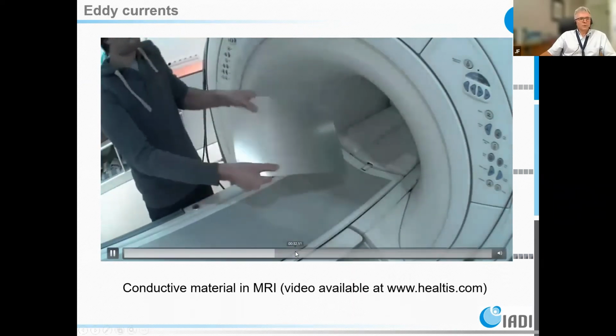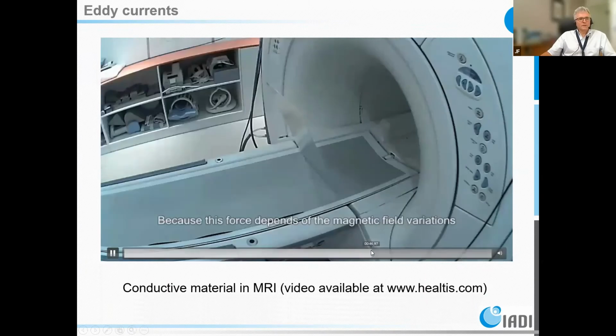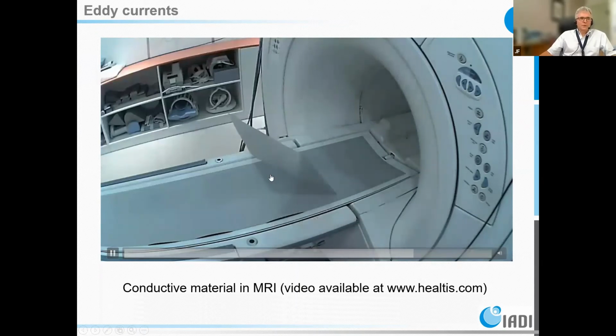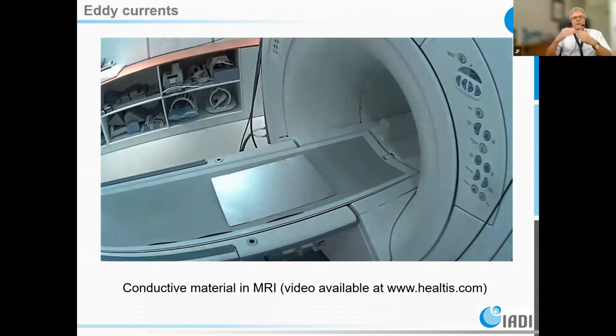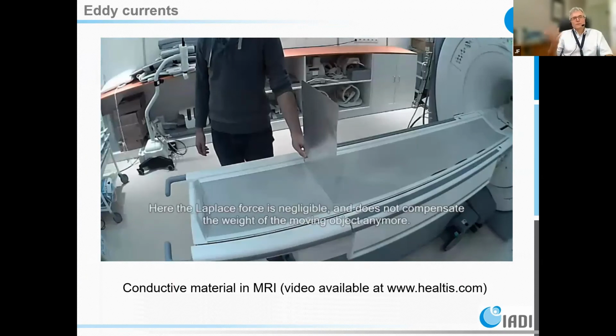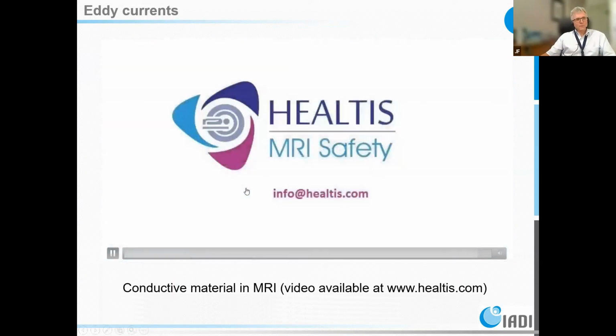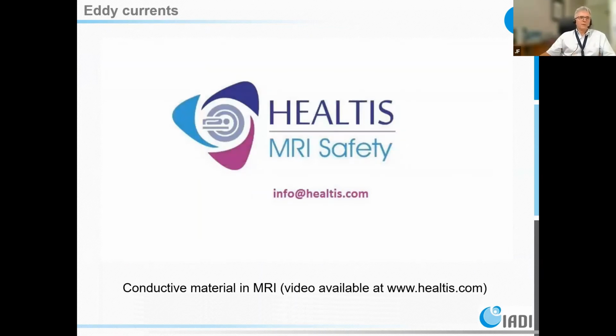And just to show you that it's difficult, I think I have this here. Okay, the plate is going slowly down here due to what we call the eddy currents. The currents are created inside this plate, and afterwards you have a force called the Lorentz force, which goes against the gravity force. If you are far away from B0, the plate goes very fast down. Okay, I will give you this again.